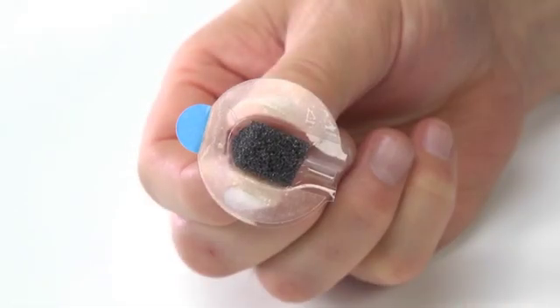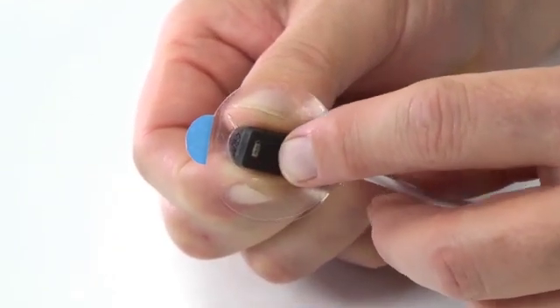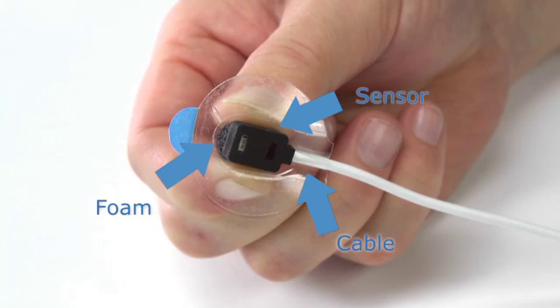Press a clean 8000R sensor into the gray foam with the emitter and detector window side facing away from the foam and the cable in the slot of the holder.